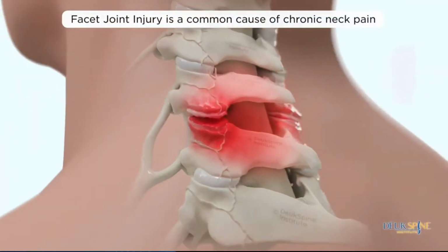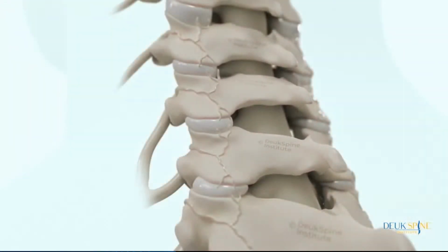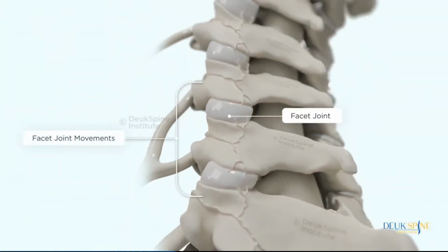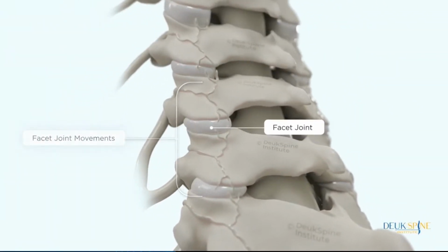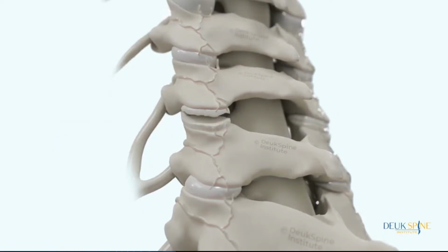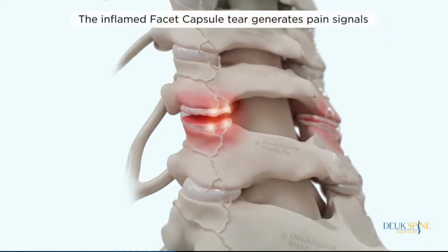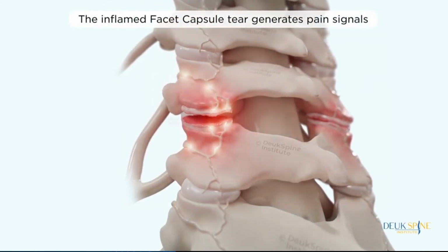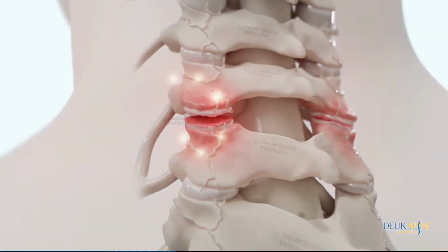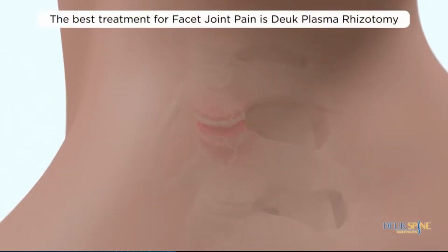Facet joint injury is a common cause of chronic neck pain. The inflamed facet capsule tear generates pain signals. The best treatment for facet joint pain is the Deuk plasma rhizotomy.